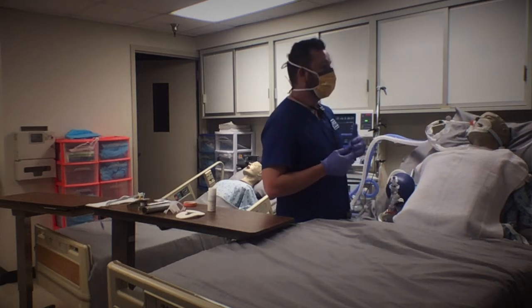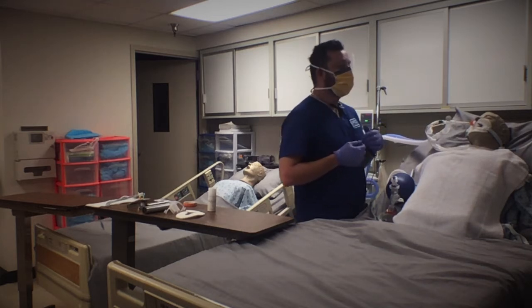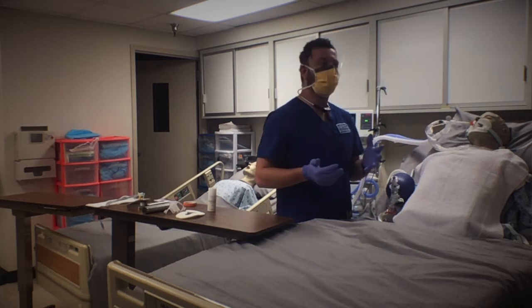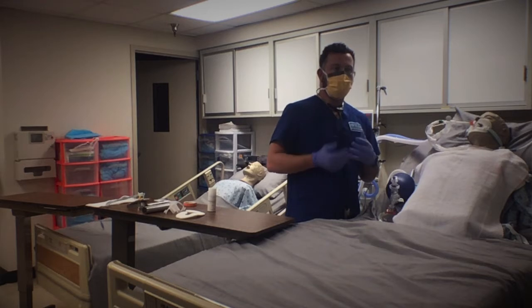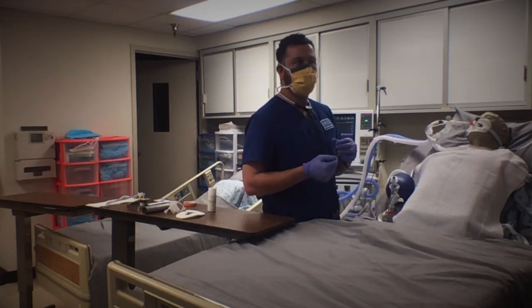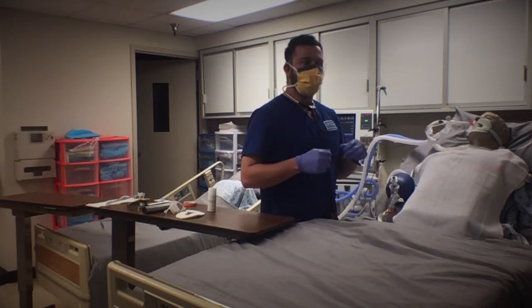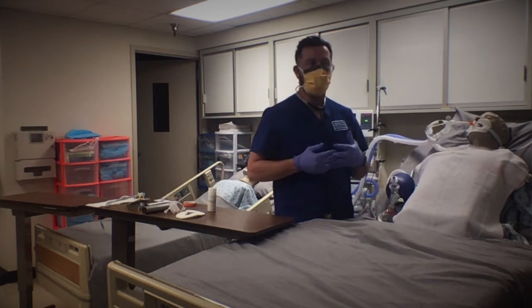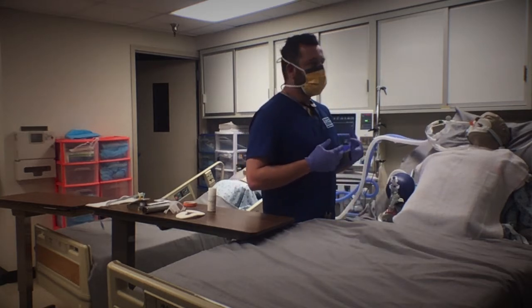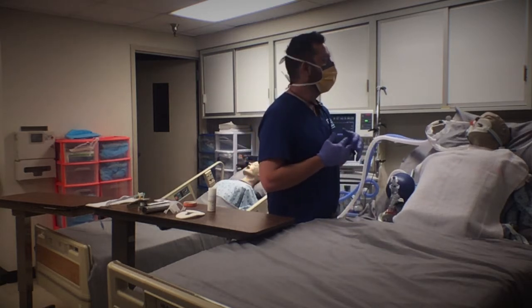Now, assess or reassess the patient. After extubation, auscultation is performed to check for good air movement. Stridor or decreased air movement after extubation may indicate an upper airway problem. Next, the patient's respiratory rate, breathing pattern, heart rate, blood pressure, and SpO2 are checked. Mild hypertension and tachycardia immediately after extubation are common and resolve spontaneously in most cases.